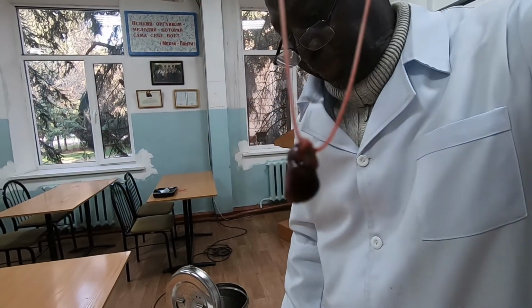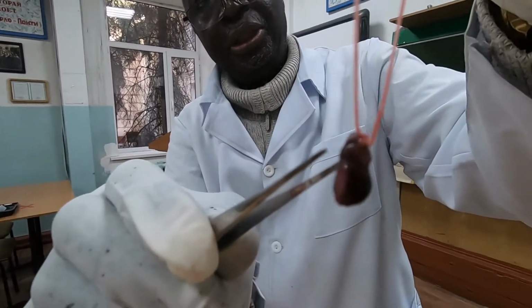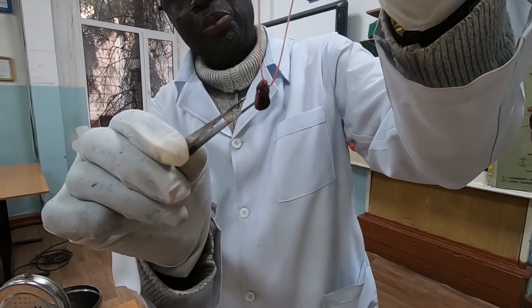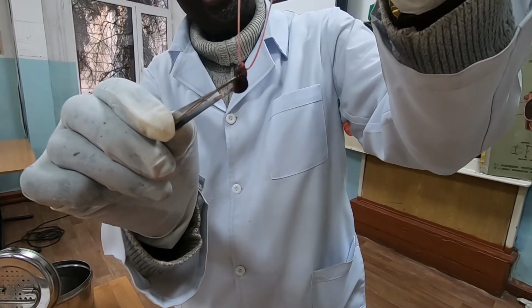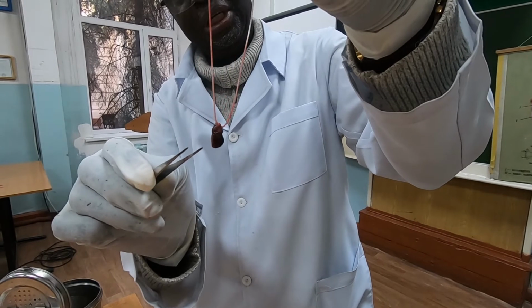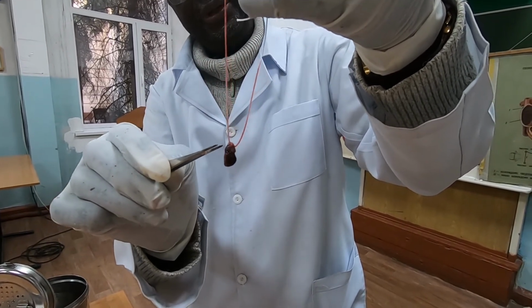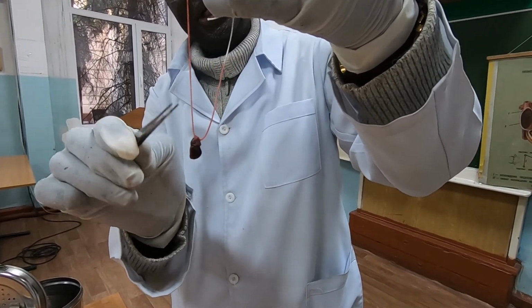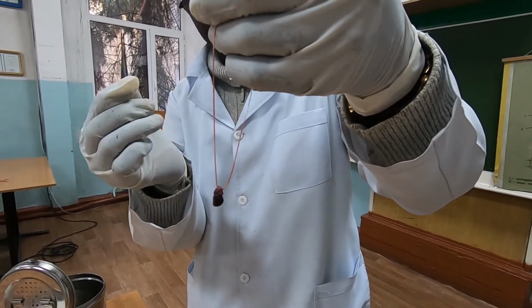You can see the upper part is darker and the lower part is lighter. So in between, we're going to tie our thread here and isolate the upper part from the lower part to show you that the energy or impulse produced in the heart is at the upper part of the right atrium.